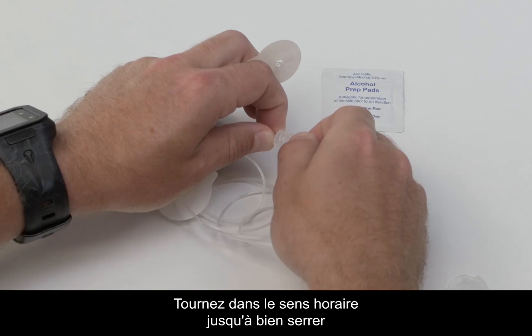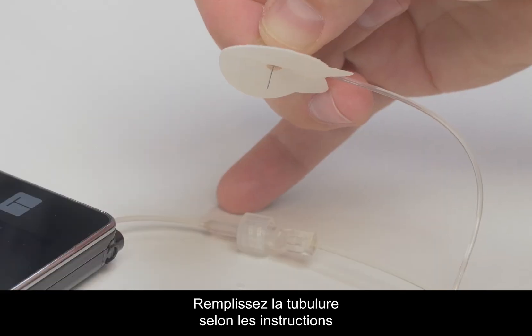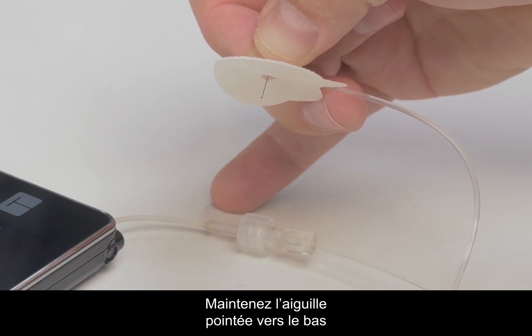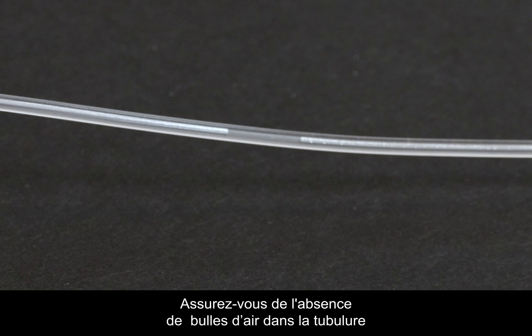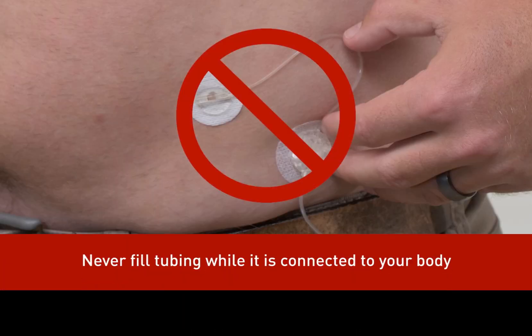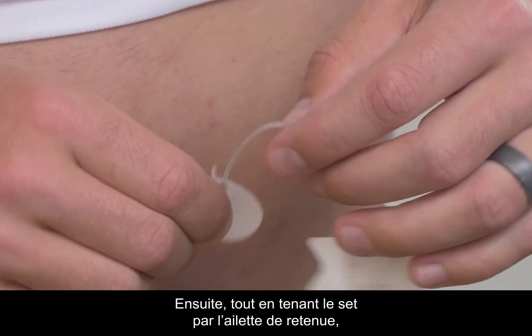Attach the infusion set tubing to the tubing lock connector on the cartridge. Twist clockwise until finger tight, then twist another quarter of a turn to ensure a secure connection. Hold the True Steel infusion set by the retaining wings and fill the tubing according to the instructions in your Tandem pump user guide. Make sure you hold the needle pointing down to ensure that insulin does not come in contact with the adhesive backing paper. Make sure there are no gaps of air in your tubing to reduce the possibility of interrupted insulin delivery. Never fill tubing while the set is connected to your body — always disconnect before filling your tubing.